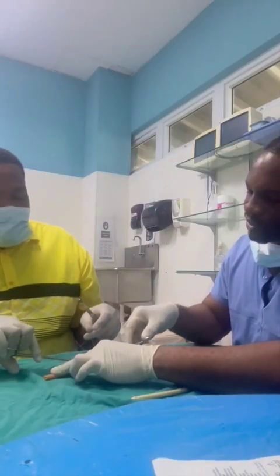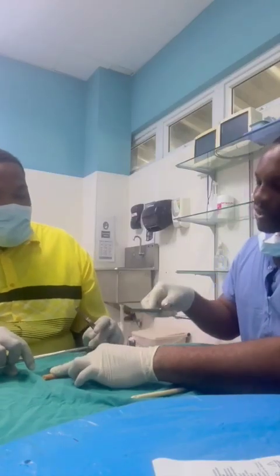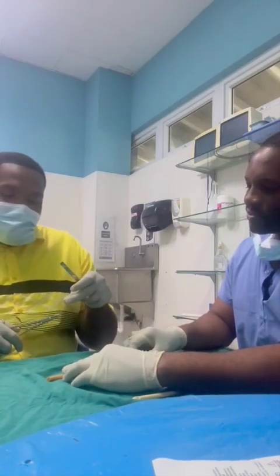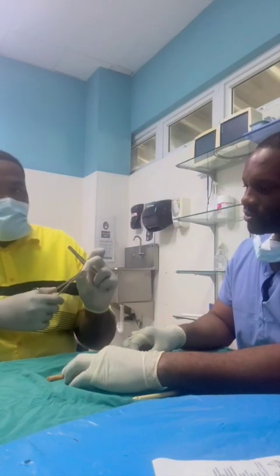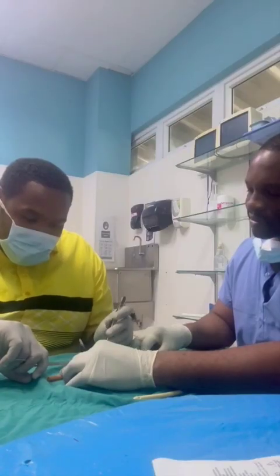I will cut. So that would end the interrupted. You just continue with that for the continuous stitch form. In the interest of time, you'll just use the same initial stitch for efficiency. You're doing very well, by the way. Use the instrument in your hand. Excellent.